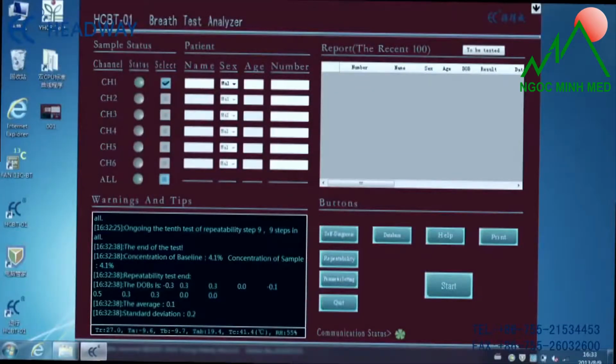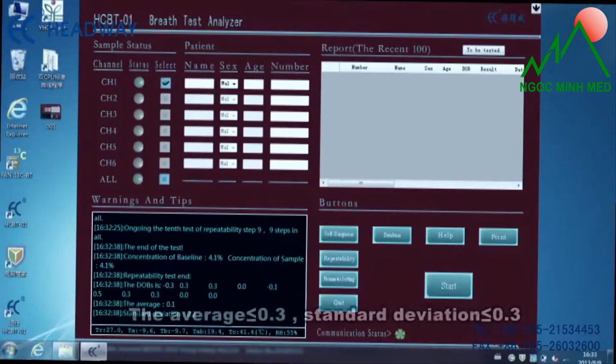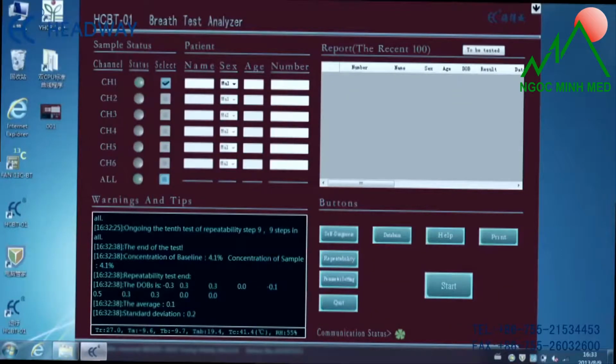QC Records column. Click on the Quality Control Record column. Choose all QC Record historical information on the interface according to the time sequence. Click a single record, or drag to check multiple records and make them light up. Then click the Print button on the Quality Control Record interface to print the Quality Control Records list.